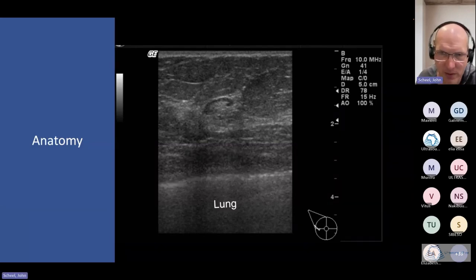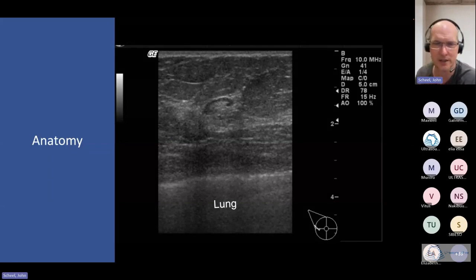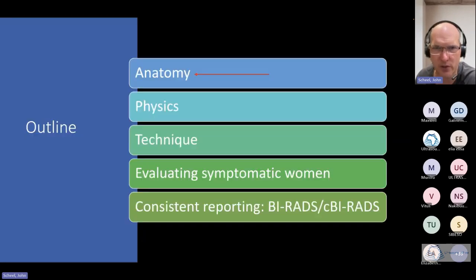It's very important that you understand that the ribs will be touching this white line, which is the pleura of the lung, because they look like scary masses. How you distinguish them is where they're located in relation to the lung and the pectoralis muscle, which means the ribs. And if they're superficial or closer to the transducer, they represent masses.